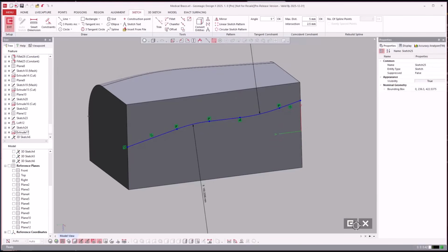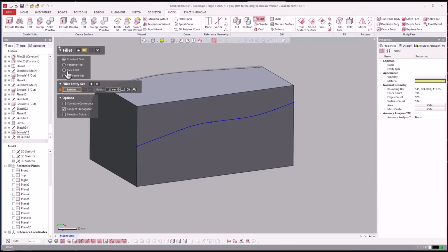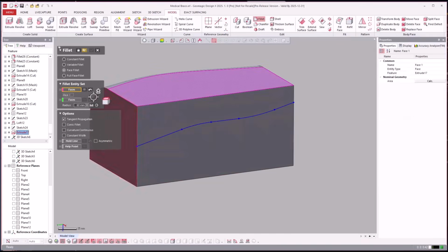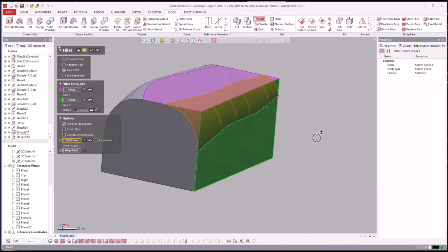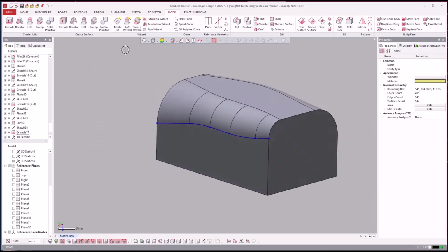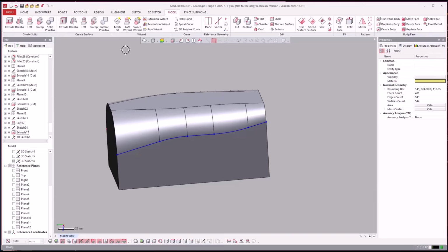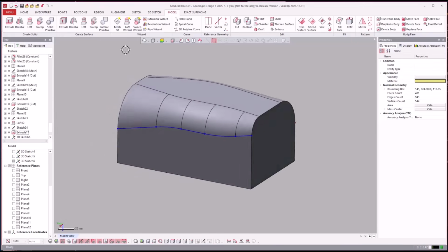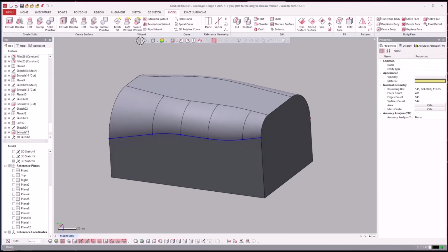Let's apply that. I'm going to try it as line arc first. So we're going to do a face fillet from here to there with the hold line. Yeah, so it'll do 2D sketches as well, which is basically what I was thinking. It doesn't have to just be a 3D sketch. So it's a really neat concept, if you can draw out these hold lines, that could be an interesting way of creating these fillets. So there's some free ones there for you.